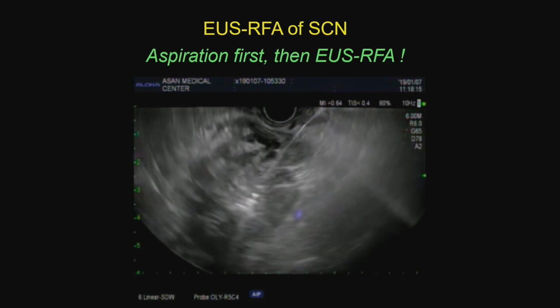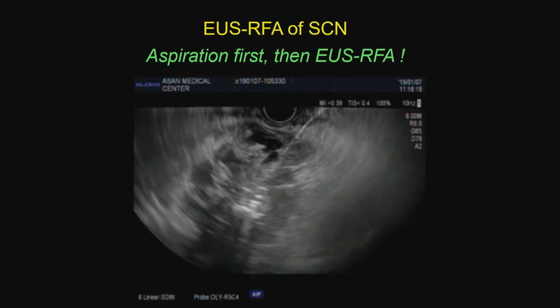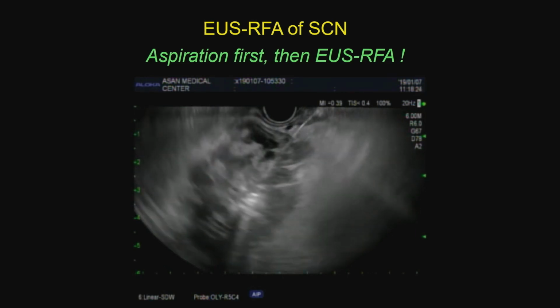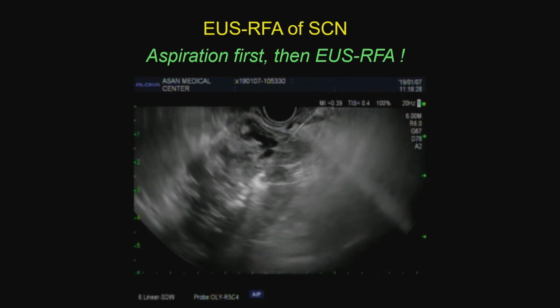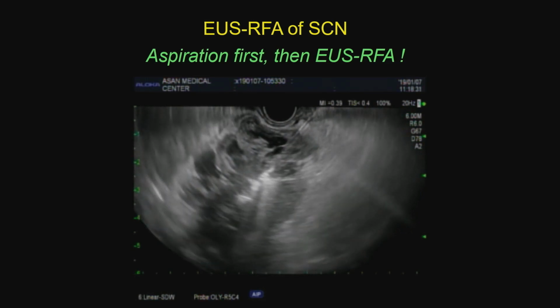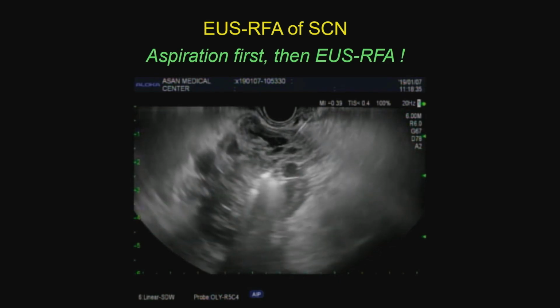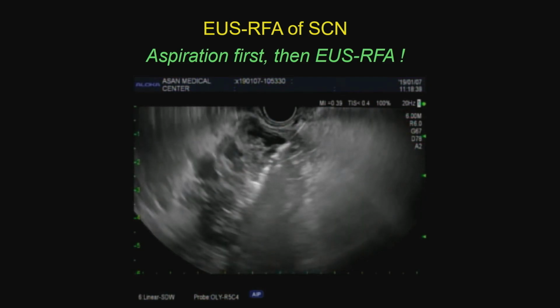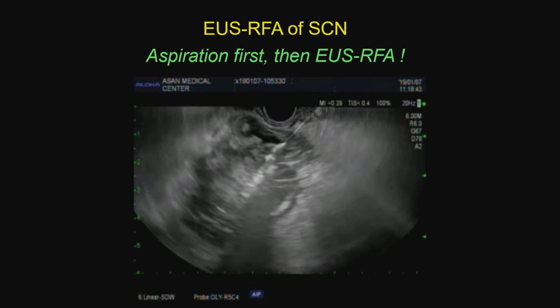And for this area, we use the line ablation, which means after deep insertion of electrodes, while directing the electrode little by little, we apply the 50 watts power continuously to cover a long area of the cystic tumor. If we do point by point ablation, it takes too much time. After this plane ablation, we try to find out another non-ablated area until the completion of RFA.